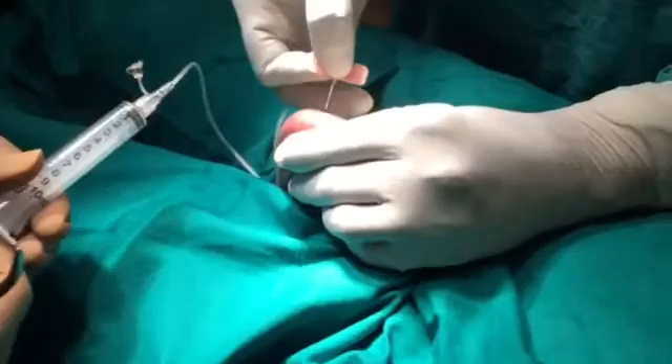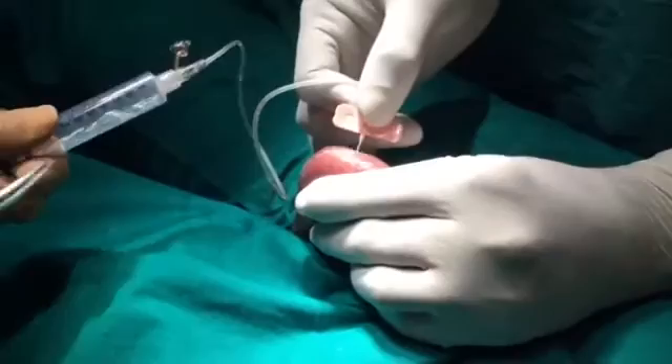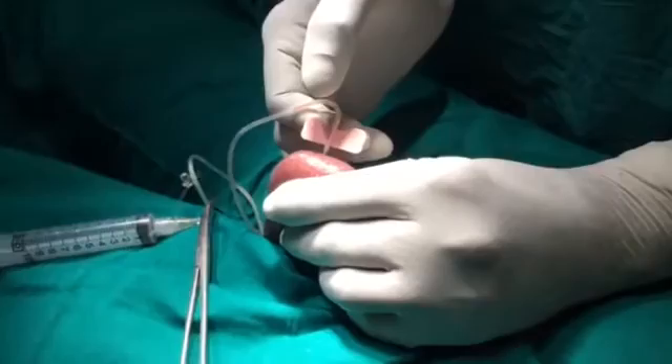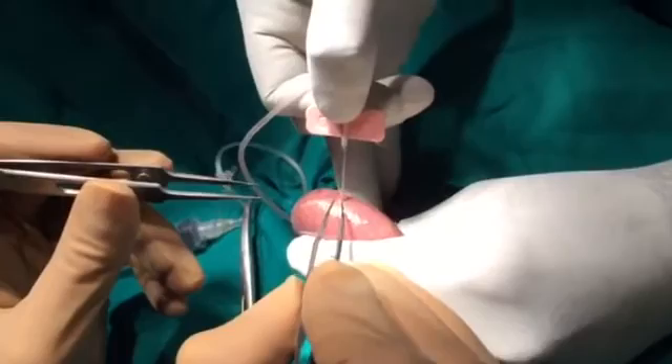So I'll give you some voice commentary. He's injecting and now I'm sucking — you can see I'm putting negative suction. What we're doing is actually sucking out tissue. This is not a fine needle aspiration cytology; it's actual tissue we're getting. You can see the thread of tissue.